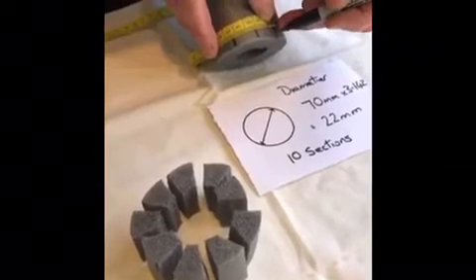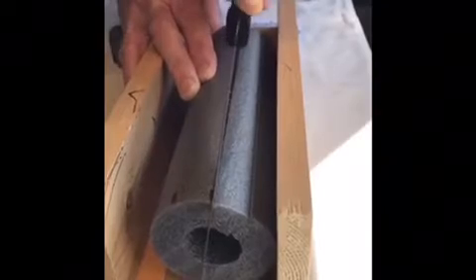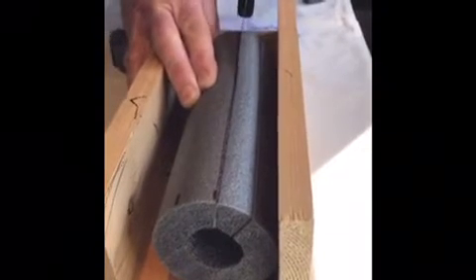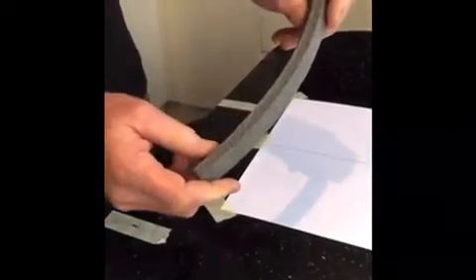Mark pipe from slit every 22mm. Cut pipe. Flex lagging to give slight bend.